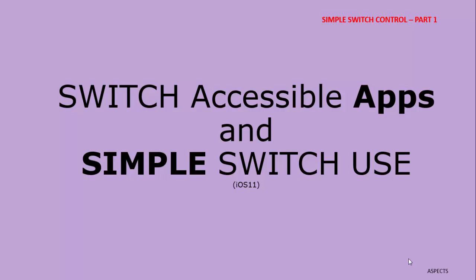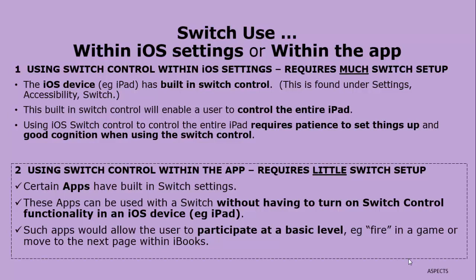Switch accessible apps and simple switch control. Switch use within iOS settings or within the app. Using switch control within iOS settings requires much switch setup.